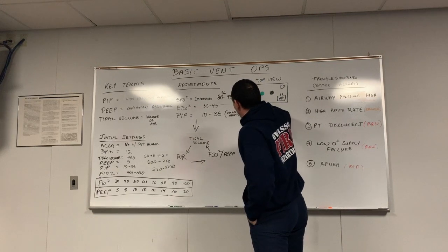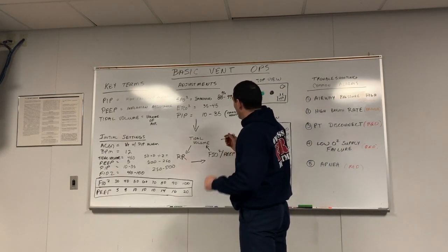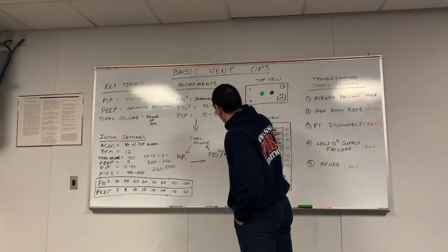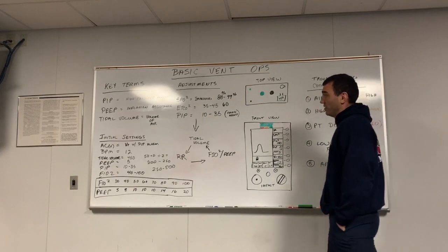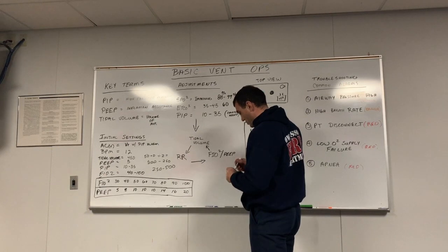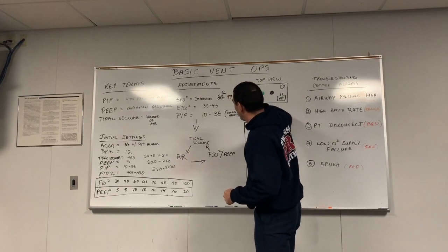Or another good example is in trauma. There's another good one. I initially have it, end-tidal CO2 is 60 on a patient that was awake 5 minutes ago. That's not normal, okay? So I can turn the respiratory rate up in order to try to lower that, okay? It's just another thing I can look at that tells me how my patient is responding to my treatment.